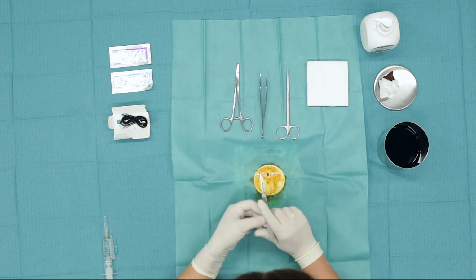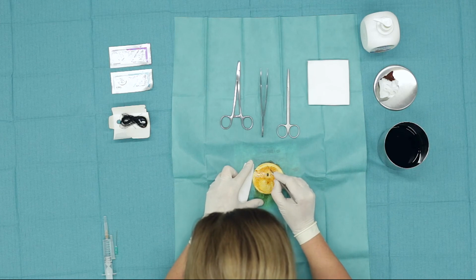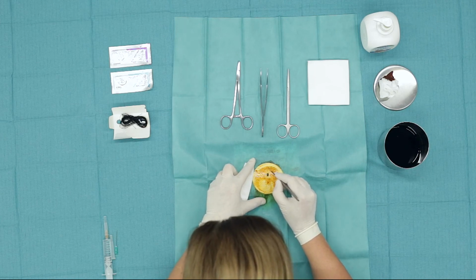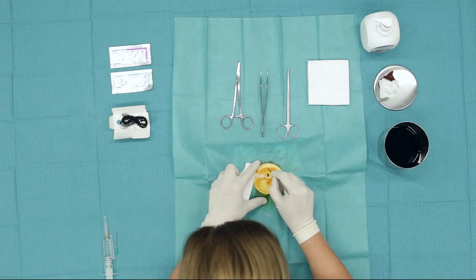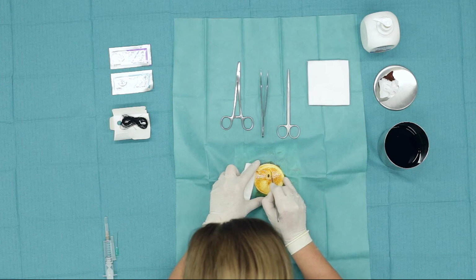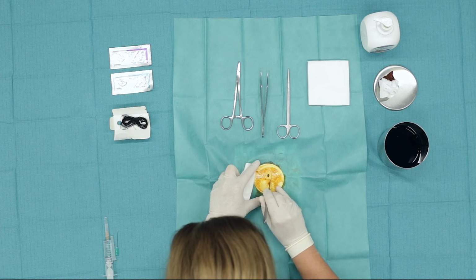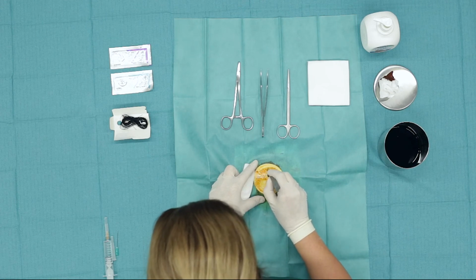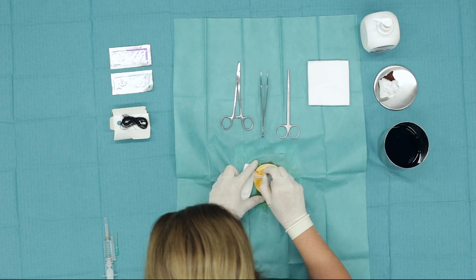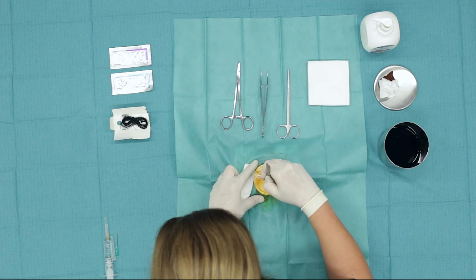I then proceed to the excision of the formation. I will make the incision spindle-shaped as we said, starting with the tip of the scalpel in the corner of the surgical wound that will be created. While moving on, the incision is made with the convex part of the scalpel, and reaching the corner again the incision completes with the tip of the scalpel. The same on the opposite side, with the belly of the scalpel, and the incision completes again in the corner of the incision, with the tip of the scalpel.